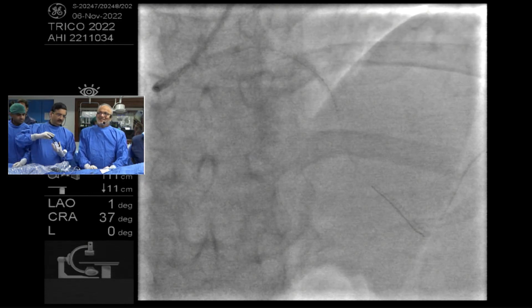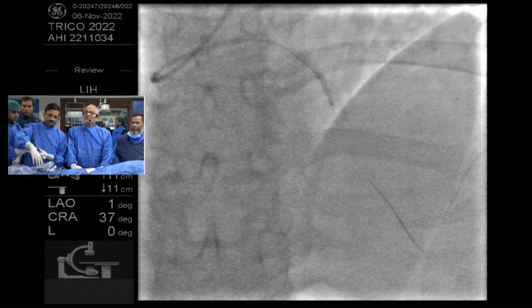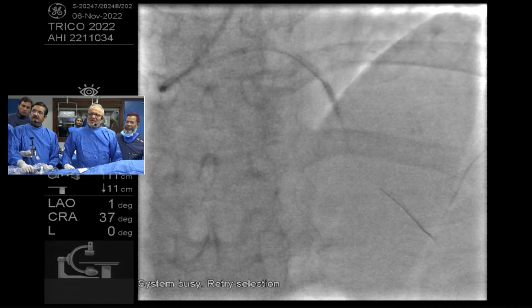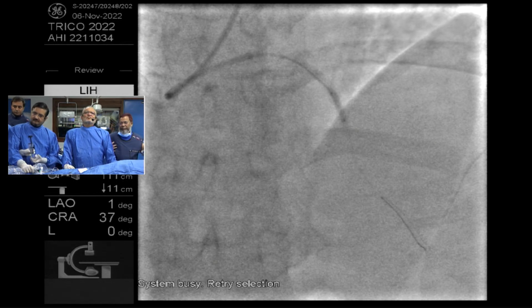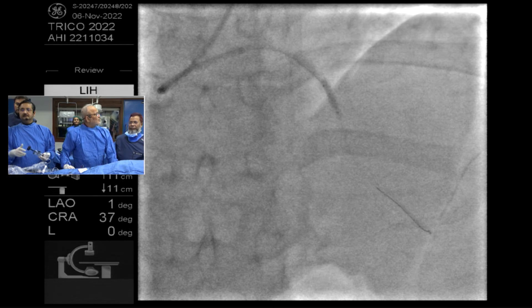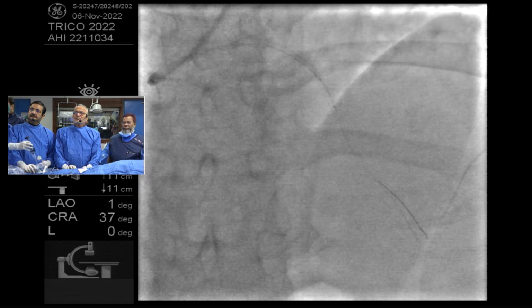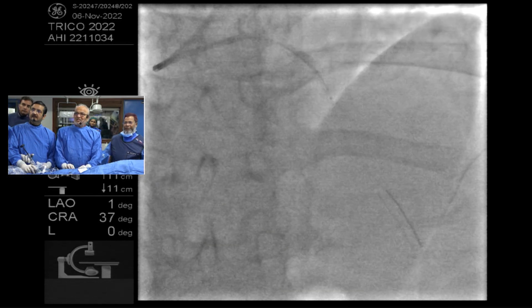I think the most common mistake we make is we use IVL in fibrotic lesions. And it doesn't work and we call it failure. And it is not expected to work. Exactly. That's where imaging helps a lot, distinguishing fibrotic from heavy calcified circumferential lesions. And cutting balloon works marvelously in those fibrotic lesions. Exactly. And you cannot quantify fibrotic lesions as vis-a-vis calcific lesions, as you don't know how they would behave. That is true. Guiding is being sucked.